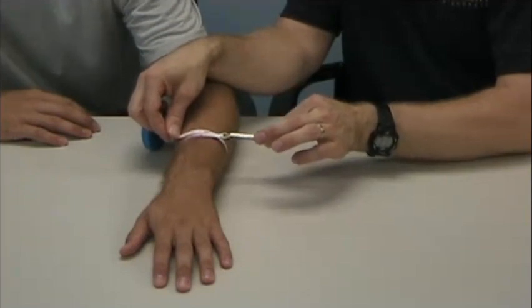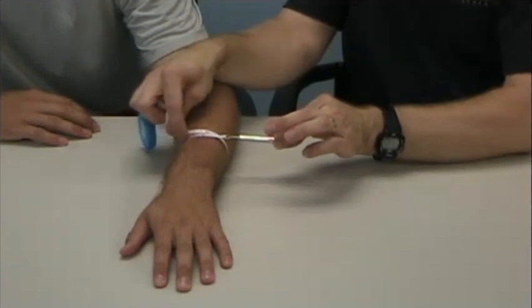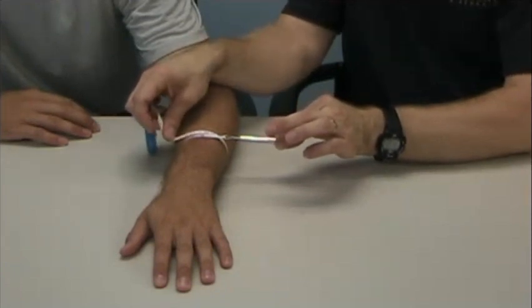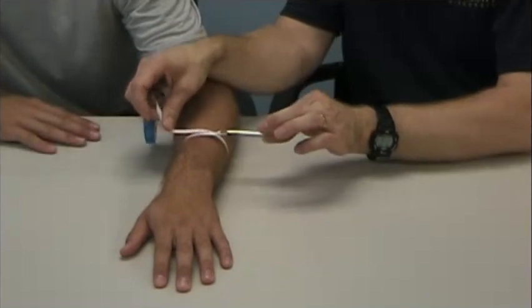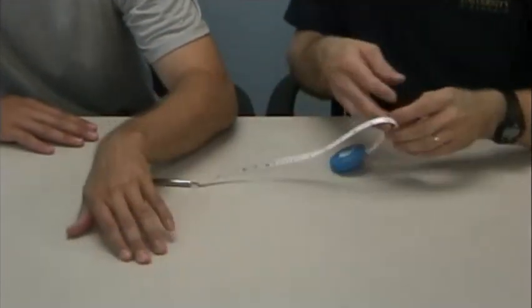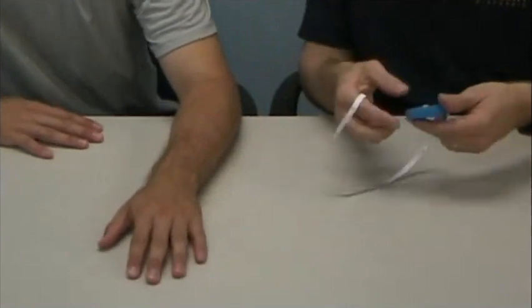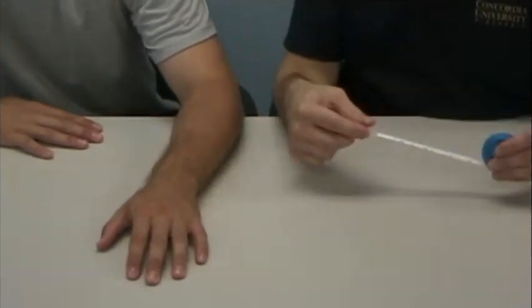One thing I don't like about this is it does put actually quite a bit of tension, as you can see on the tape. So if you have somebody with a soft or mobile edema, you're actually going to change the edema as you hold it here. It'll flow out from under your tape with that amount of tension. So it's not a perfect solution, but it is one solution that's out there, and I thought I'd make you aware of it.